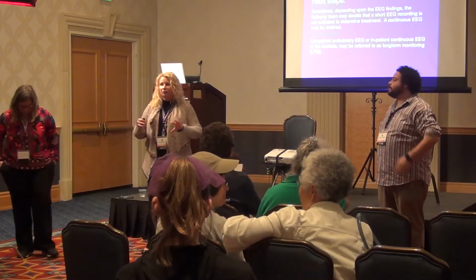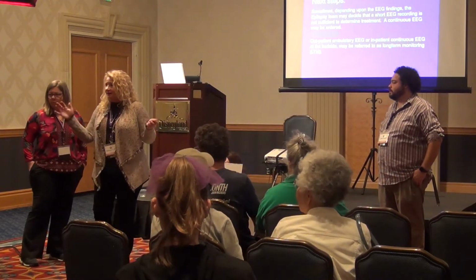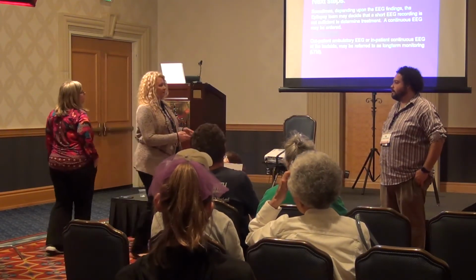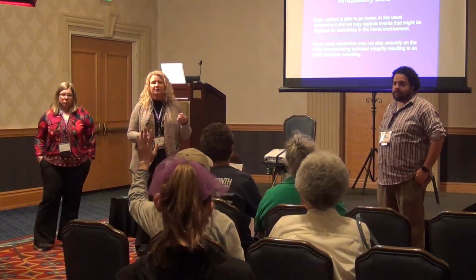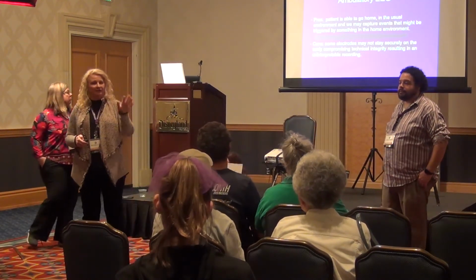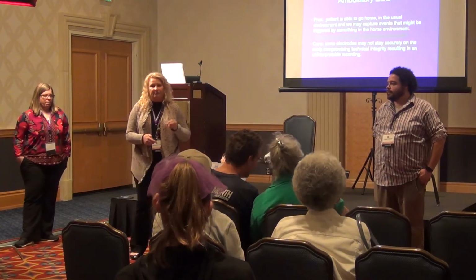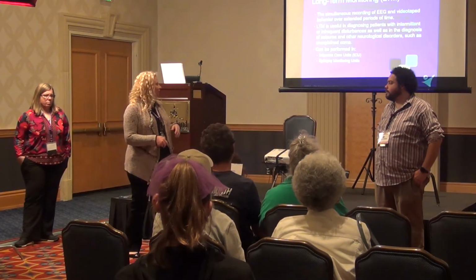So just so you know the importance of that, the first thing is finding out, okay, on the EEG, in that short period of time, we may have some contributing information, or we may not, and we need to do further assessment. So ambulatory EEG, has anyone had an ambulatory EEG done? Okay. So you go home with the device, recording your brain activity, and then come back, and then that data is assessed, right? Based on those findings, we may or may not capture what we're looking for, and then your physician may decide to admit you to an epilepsy monitoring unit for long periods of time.